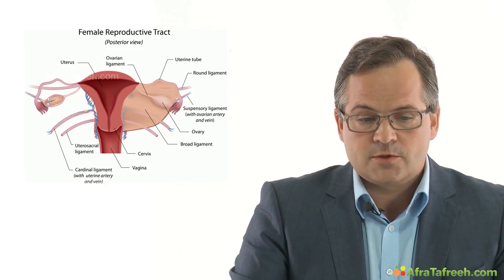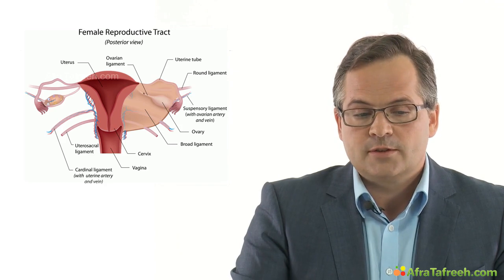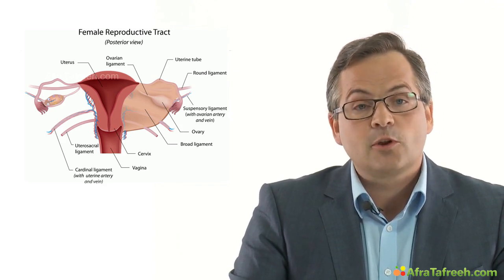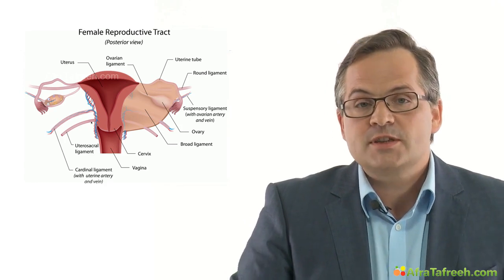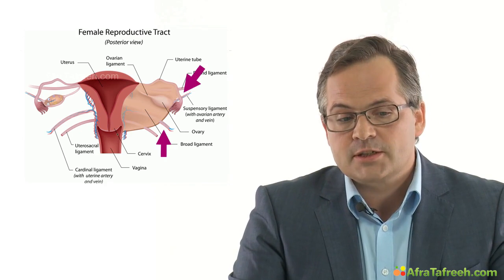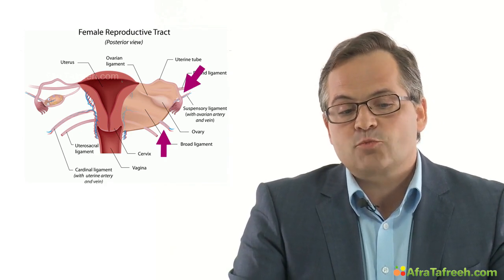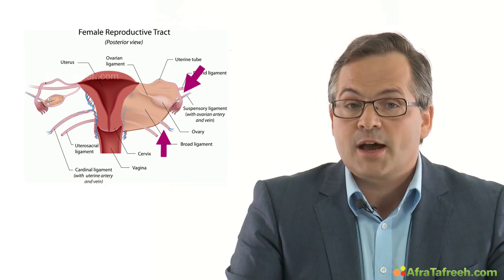We see the uterus with cervix, body and fundus, the ovary on both sides, and the fallopian tube. And nearby the ligaments, we see the guiding arteries for the ovary, the ovarian artery, and also sometimes branches from the uterine artery, which supplies the gonads on both sides.